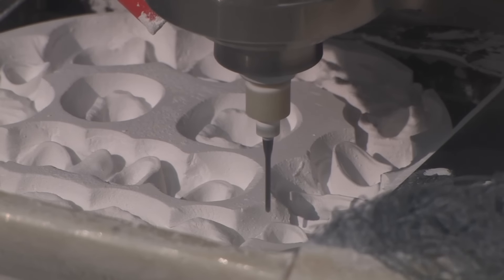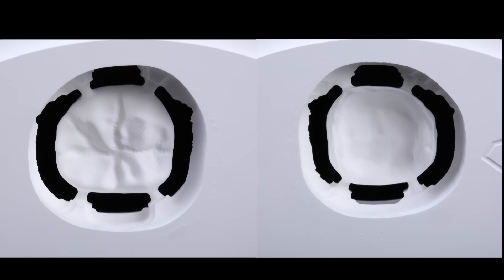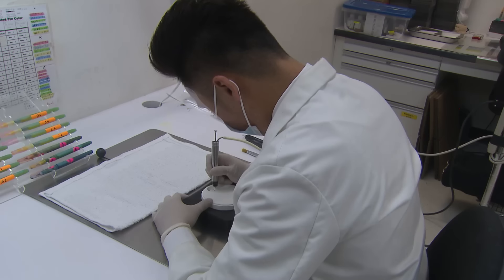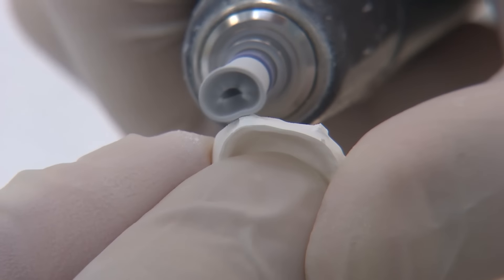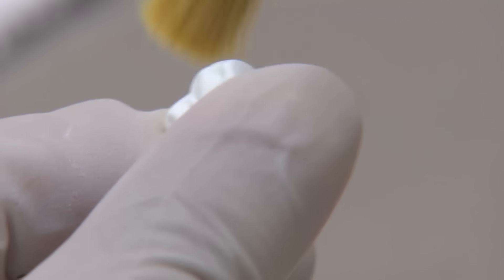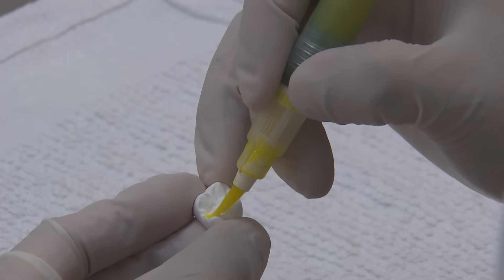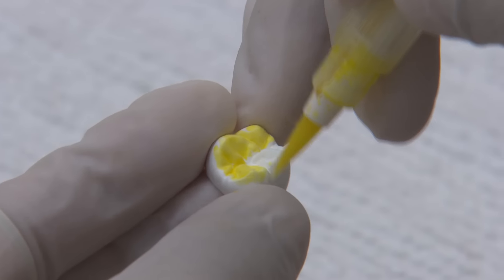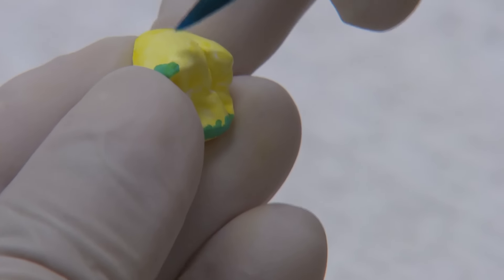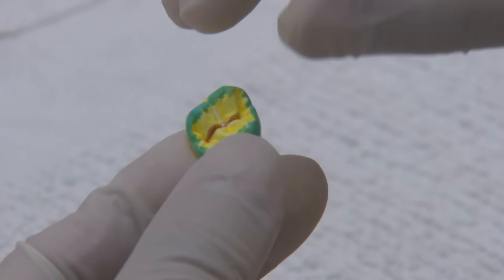As soon as the digital design is completed, the file is transferred to one of our many Bruxer milling machines where the restoration is precisely milled in a green state. Using a high speed and a rubber polishing wheel, a technician carefully removes and blends in the crown's sprue attachments from the block to ensure all that remains is the proper final contour. Once that's completed, special coloring dyes are then applied to specific areas of the restoration that will absorb during the six-hour sintering cycle. The technician places the colors according to the shade prescribed and also to add depth and translucency to the restoration.